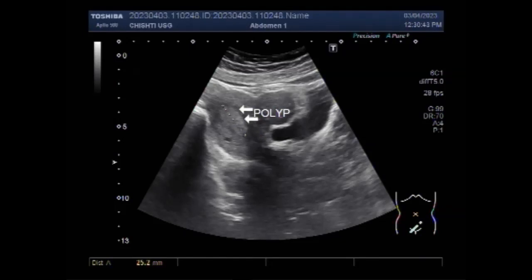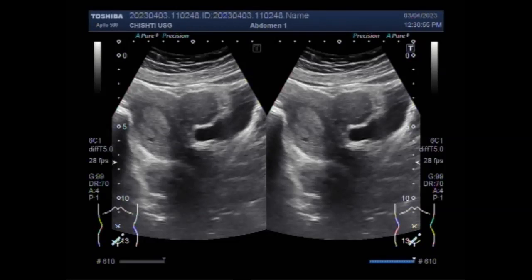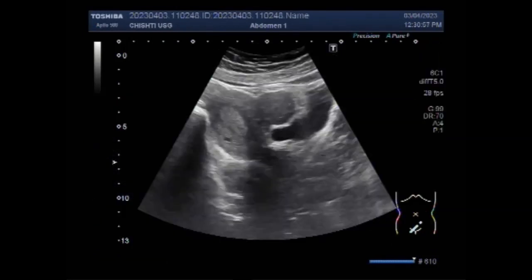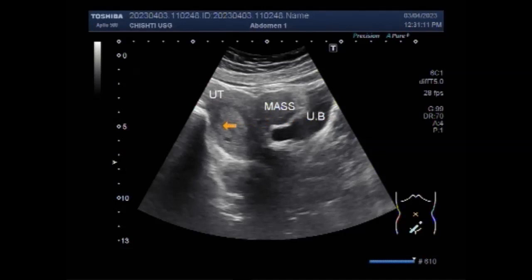Now you can see the uterine polyp in the distal portion of the uterine cavity. Now you will see the labeling of the anterior wall fibroid — this is the uterus, and this is the fibroid seen in the distal portion of the uterus.